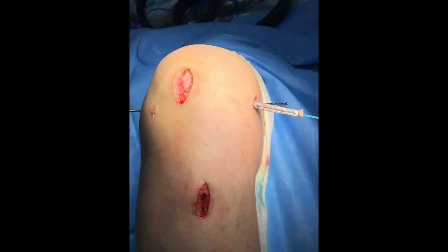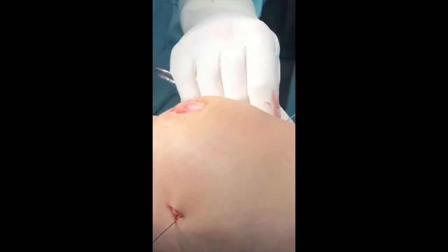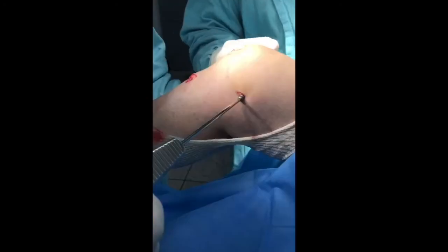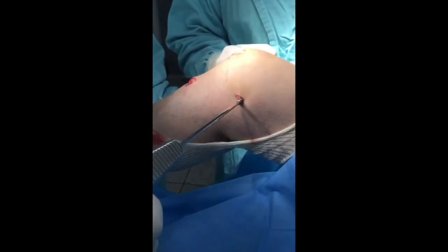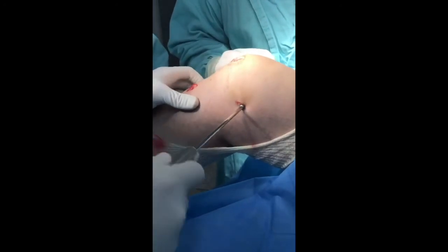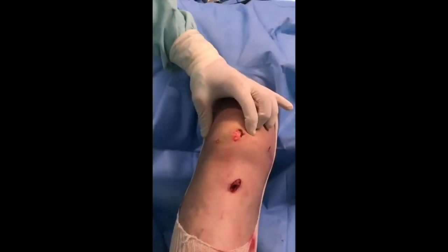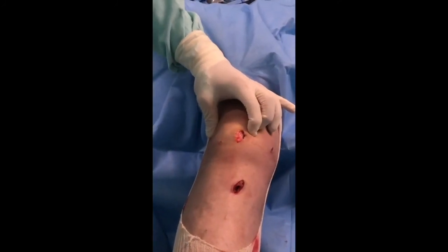The knee is then flexed to 60 degrees. With the patella centrally located in the groove, slack is removed from the graft and it is fixed with a 7 by 25 millimetre soft tissue interference screw. Normalised patellar tracking and a hard end point to the MPFL reconstruction are confirmed prior to terminating the procedure.